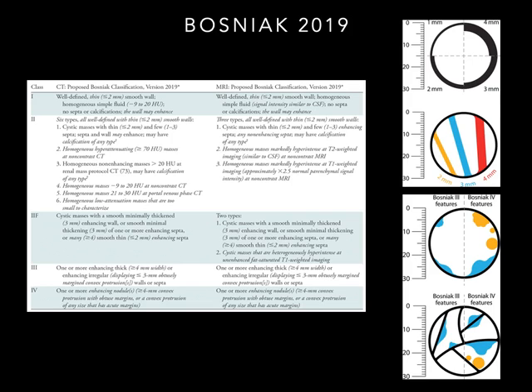And with this new classification, calcification does not count as a sinister feature. So lots of scans that we've seen that were previously 2F have now been downgraded to 2, and that means a much smaller follow-up burden.